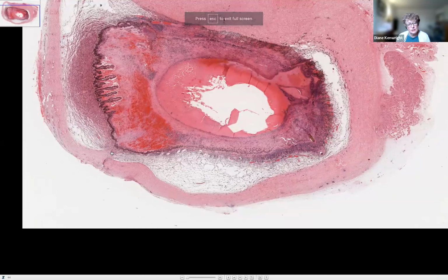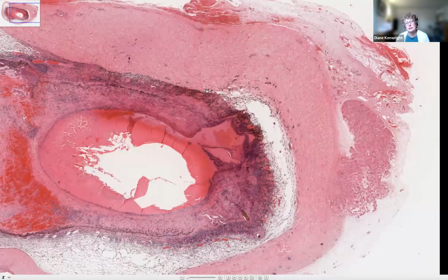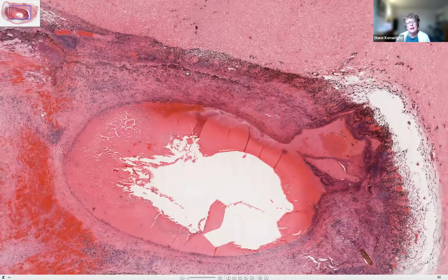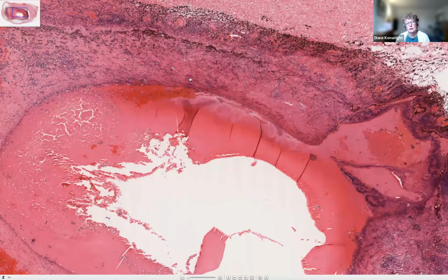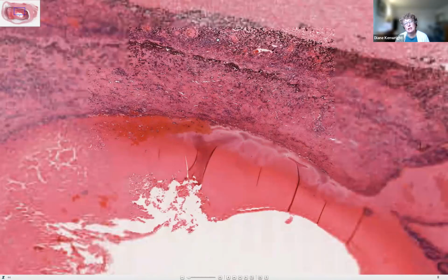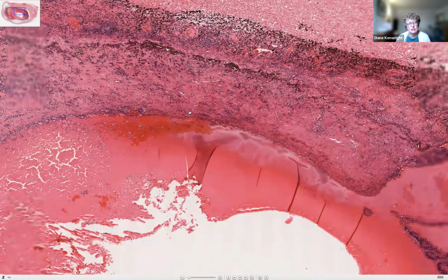Okay, so as I look a bit closer, I can see that there's a whole lot of inflammation. So I'll just go from here. This is the thickened sclera. As we go closer, we can see that there's a whole lot of pigment, and this is from the metaplastic retinal pigment epithelium, which you can see here proliferating. It's just taking a little while to load there. And then in the background here, we've got some chronic inflammation mixed in as well. And the RPE here is undergoing fibroblastic metaplasia and forming this dense collagenous fibrous tissue.